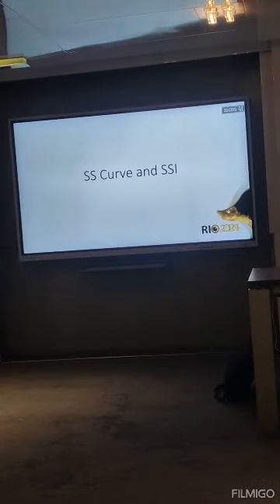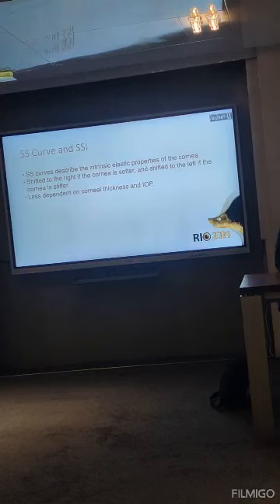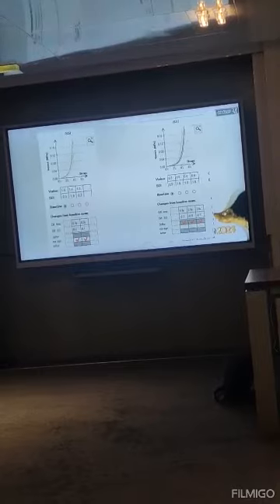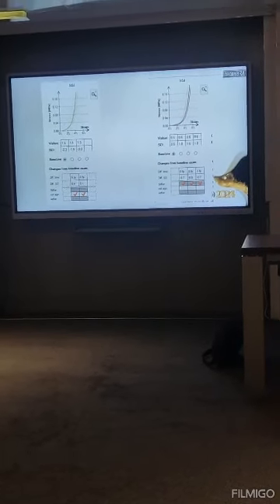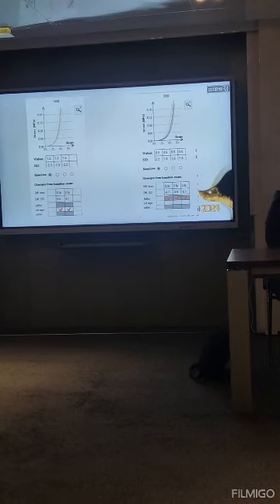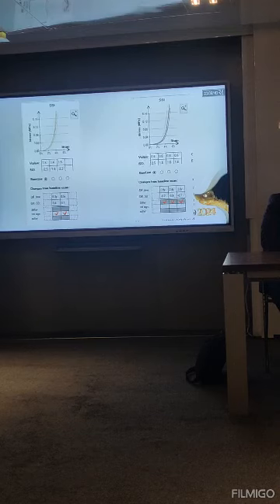We have something called the stress-strain index and strain curve. If I try to explain it right now, I'm going to be a theoretical physicist, so I will skip it now. But the curve, you can compare it to the main index. If it's moved to the left, the cornea is harder or stiffer. If it's moving to the right, the cornea is softer. And you can use this curve specifically for follow-up, especially after cross-linking, after stuff like this. And you can have this indication here, so the cornea is stiffer afterwards, or the cornea is showing no signs of progression here.